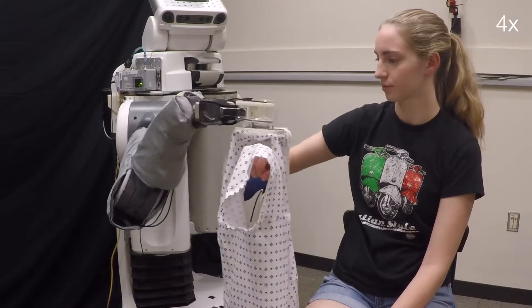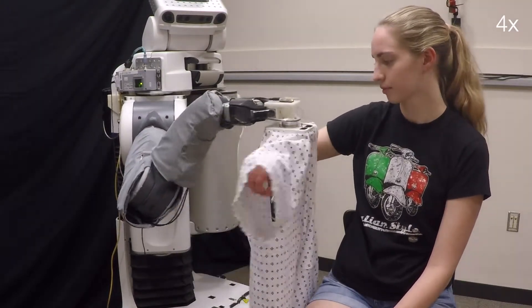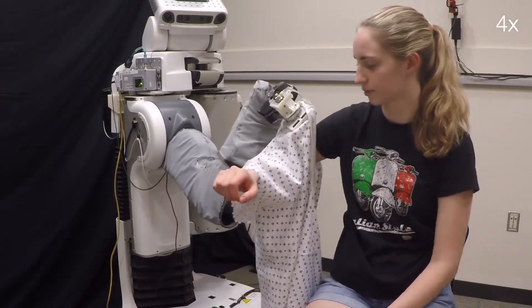Overall, results remained consistent across all participants as the robot successfully tracked arm movement and pulled the gown up to each participant's shoulder.